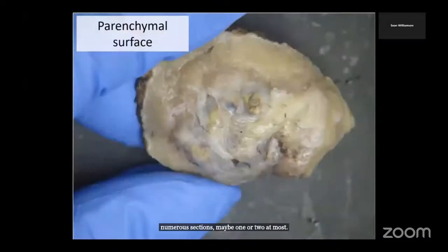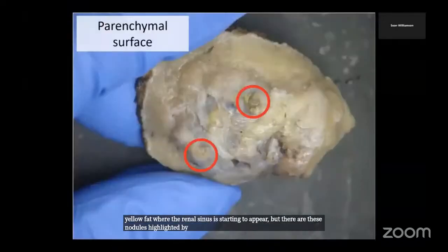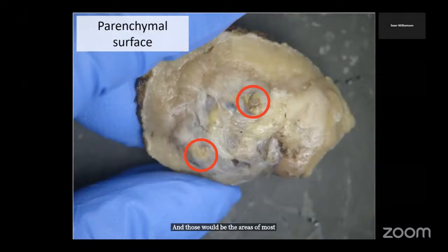On the other hand, the parenchymal surface of the partial nephrectomy specimen may be more revealing. Here in this specimen, we can see some yellow fat where the renal sinus is starting to appear, but there are these nodules highlighted by the red circles where I think we can start to see that the tumor is bulging toward the margin, and those would be the areas of most interest for a potential positive margin.